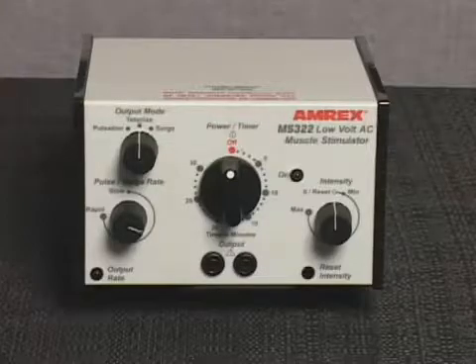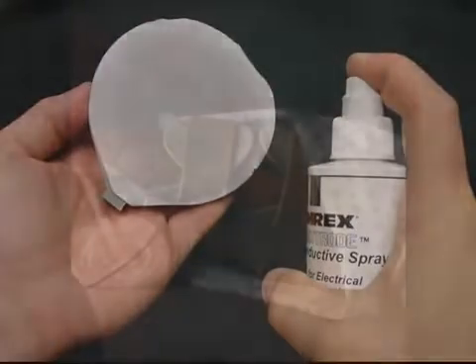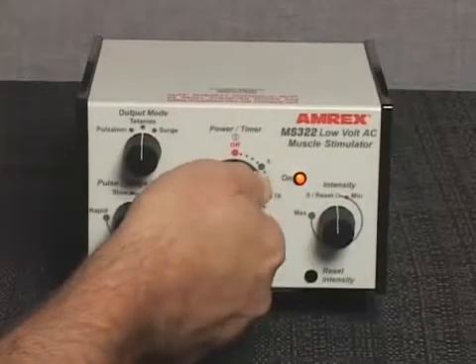During the initial patient setup in surge or pulsed modes, prepare the pad electrodes and apply them to the patient. They may be held in place using retention straps or weight bags.